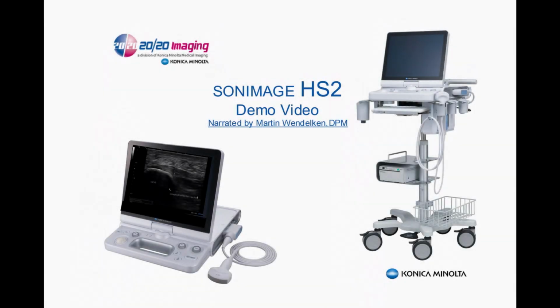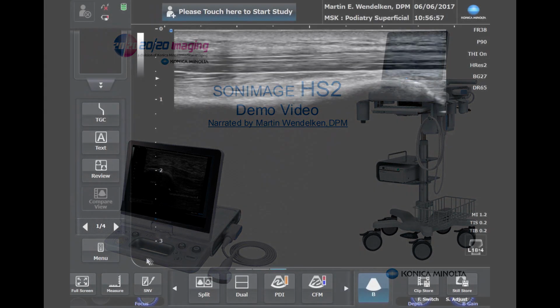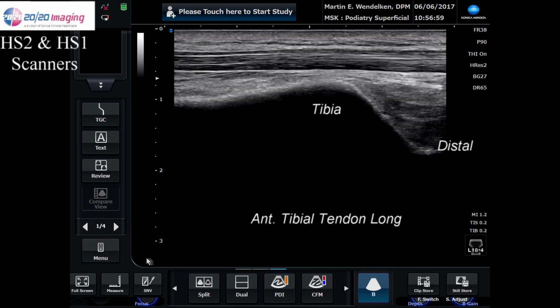This is a 10-minute video demonstrating the HS2 ultrasound scanner. Let's begin by looking at the anterior tibial tendon in the longitudinal axis.